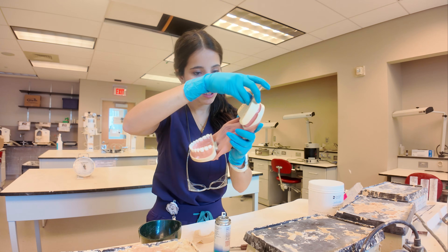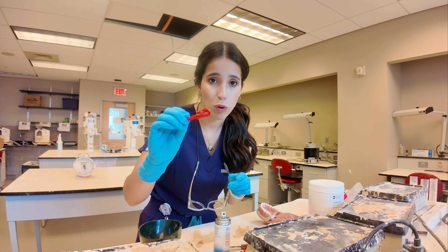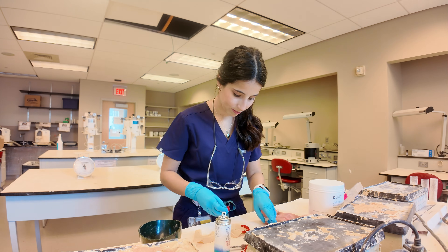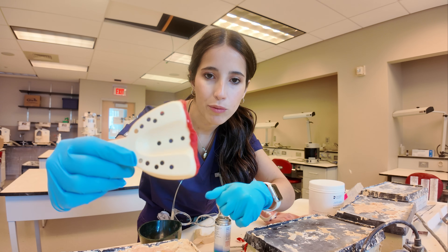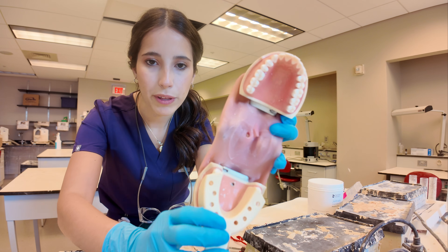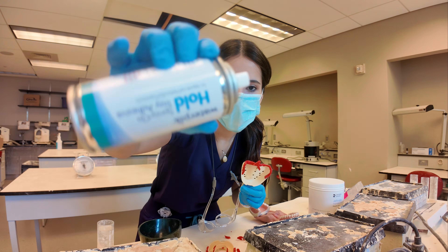Let's see if it works. Looks like it covers most of the teeth, but there's a little bit of the third molar showing. So what we could do is use rope wax to cover the edges of the tray to make sure that it encapsulates all of the teeth. You can see with the rope wax, we've extended this tray a bit more to make sure all the teeth are captured. The molars are really showing on the mandibular tray, so I need to cover that part with the rope wax as well.